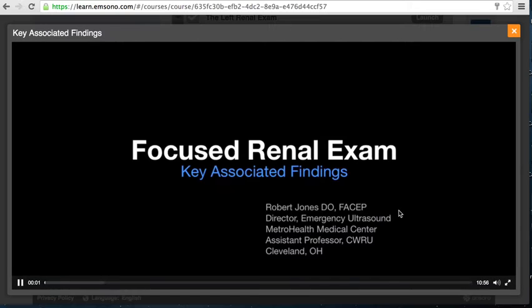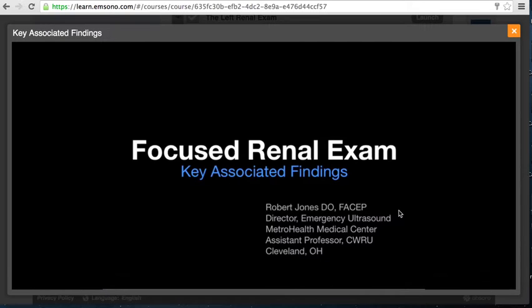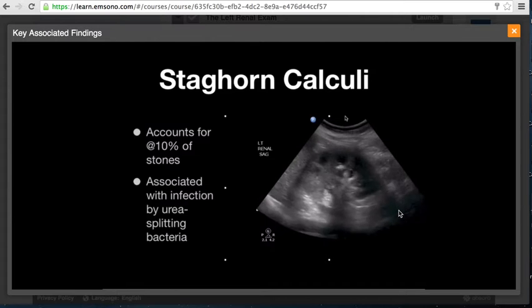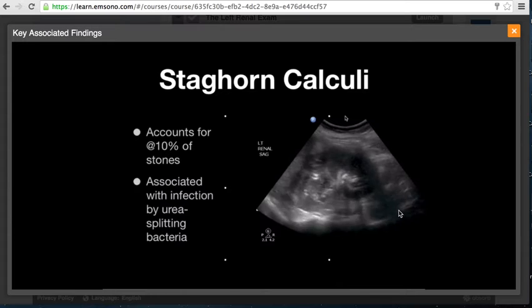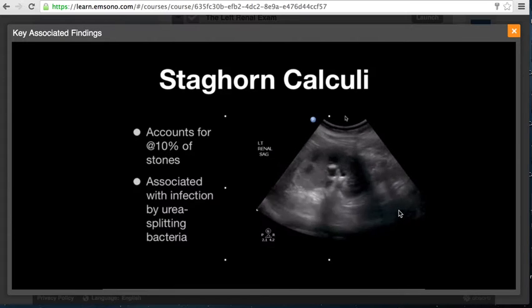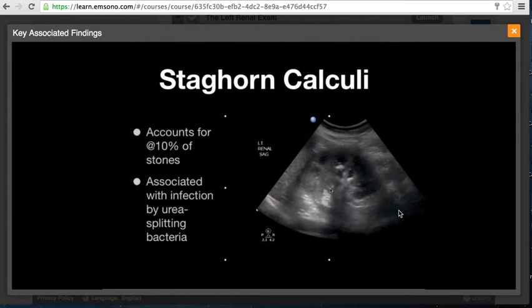I'm Dr. Robert Jones, and in this video we're going to be going through some of the key associated findings that you're going to come across during a focused renal examination. Now, staghorn calculi, they're going to account for about 10% of all kidney stones, and frequently they're associated with infections caused by urea-splitting bacteria. Here is a patient with a staghorn calculi.